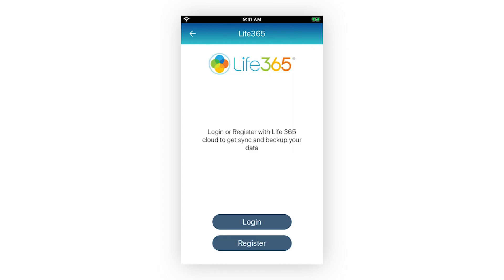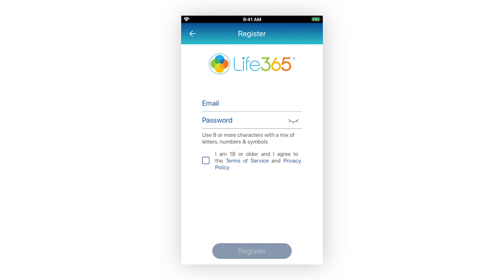To create an account, select Register. Enter your email address and create a password. Review Life365's Terms of Service and Privacy Policy, then check the box once reviewed. Select Register to proceed to your account.